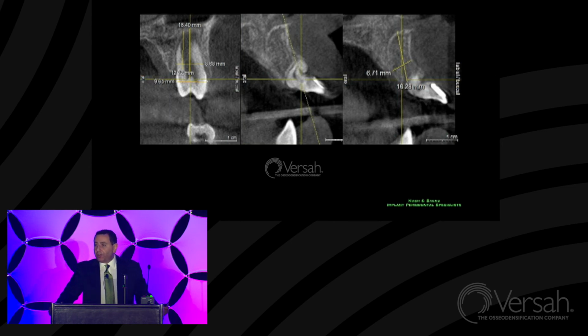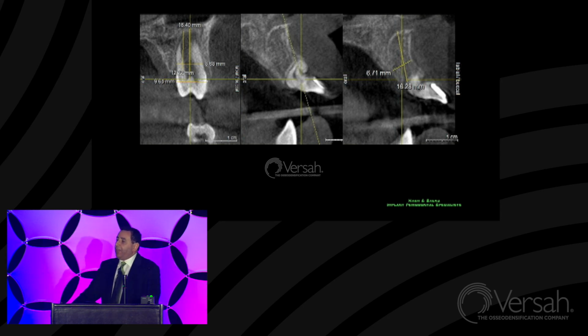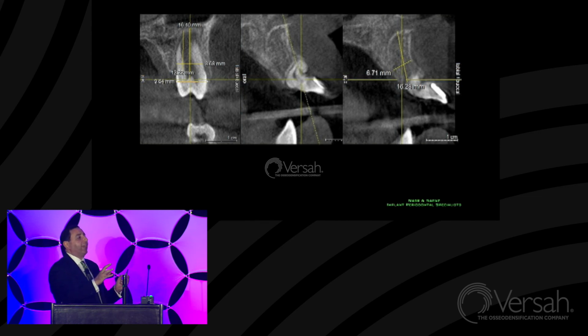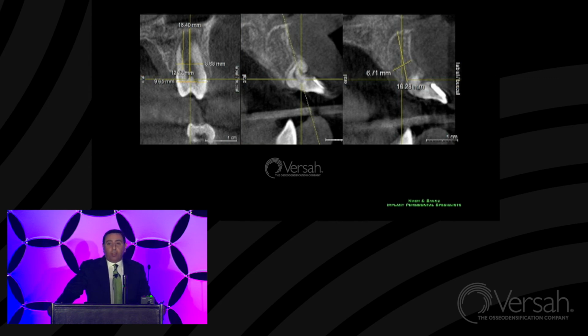One thing also I've learned over the years is when you place an implant in a congenitally missing tooth, about 75% of the time, the moment you pass the cortical plate, you're going to drop into a huge marrow space. There is nothing there. It's complete atrophy of the trabecular bone, and it's a hollow area, just like what you see when you remove a cyst, and there's just a large gap. It's almost like you dropped into a sinus. And I've lost a couple of implants like that about 10, 12 years ago, and I learned my lesson. So I've now, in those cases, been grafting the bone first and then coming back and putting the implant.